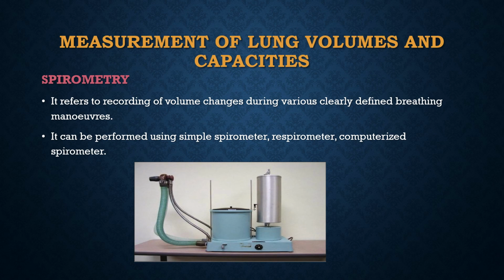Spirometry refers to the recording of volume changes during various clearly defined breathing maneuvers. That is, certain breathing maneuvers the patient or the subject is asked to do, and while he is performing those breathing maneuvers, we have to record the volume changes using the spirometer. And the graphical record of those volume changes is nothing but the spirogram.